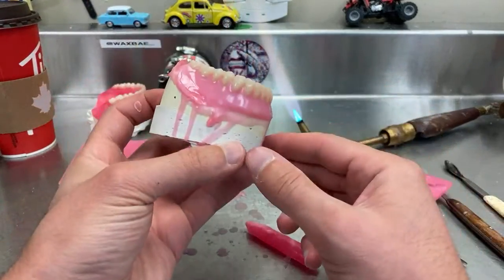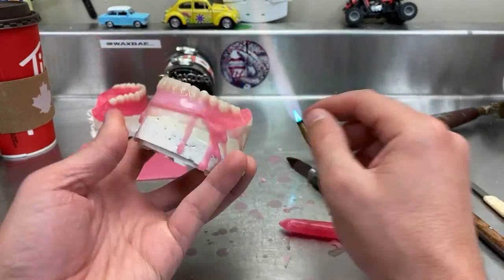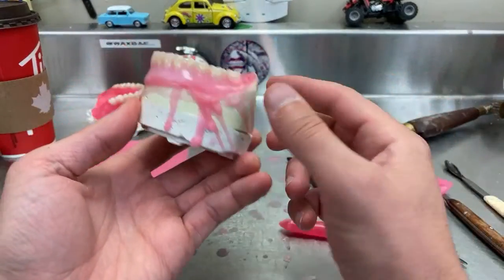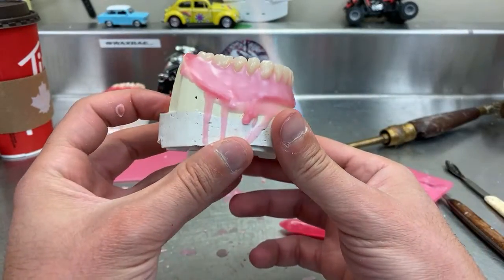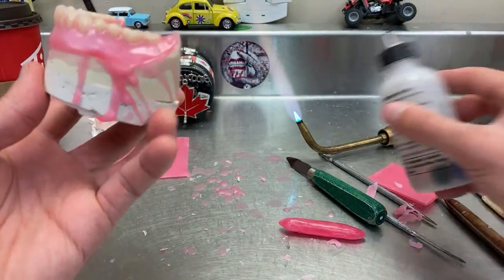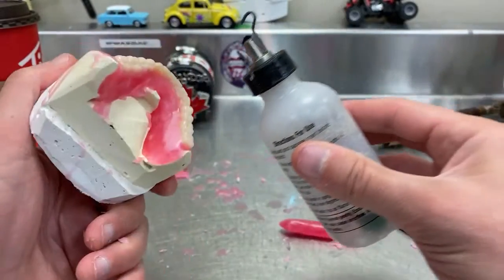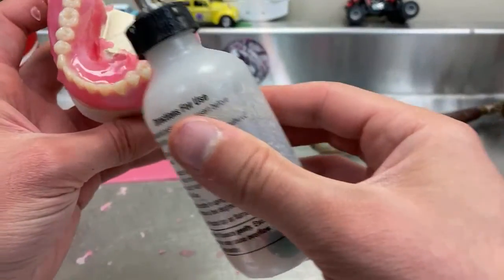And the thing that I'm doing here is very dangerous, so I'd recommend you be careful with how fast you run those on the fire. Because if I'm half a second longer than this, it will actually burn the teeth. So you have to be very careful, and the flame hitting here instead of the actual teeth. And if you feel like you have to do it, go with this, because you can control it better. If you burn your teeth, don't blame me.